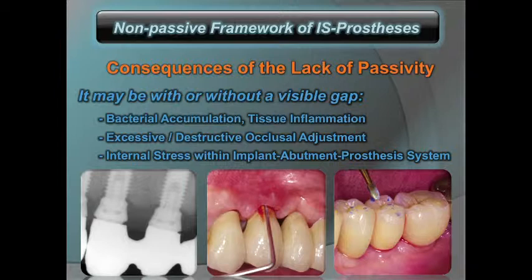Second is the occlusal adjustment. You place the implant, you check the occlusion, it's completely off. It's 100% more than what you want. The patient is saying that it's just too high. It's mostly because it's not completely seated and it's not exactly the way that the technician designed it. And you end up ruining the anatomy feature.